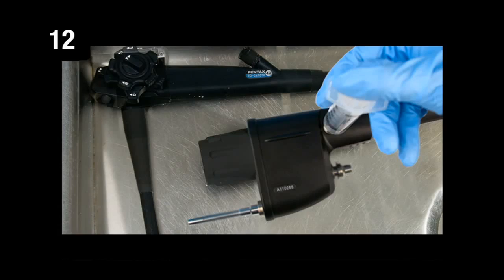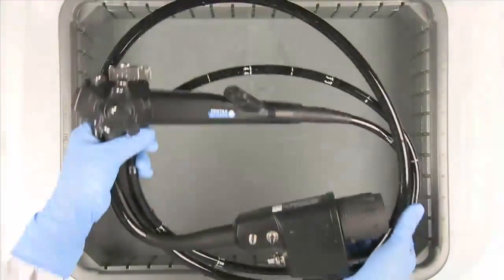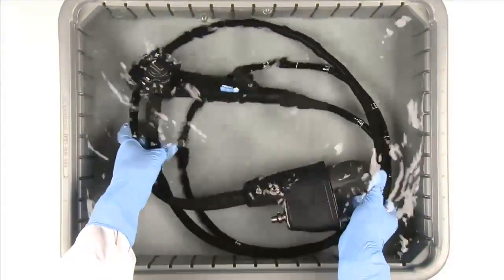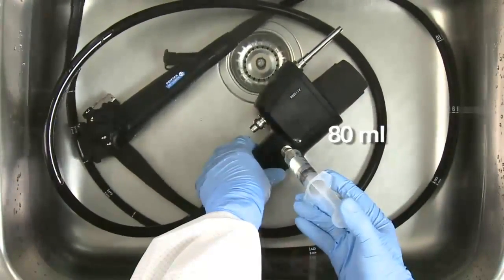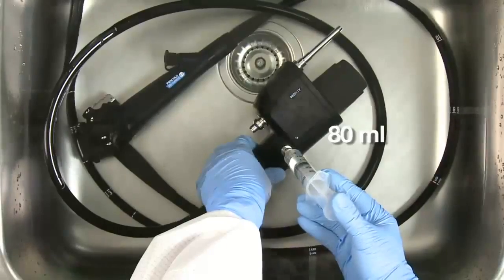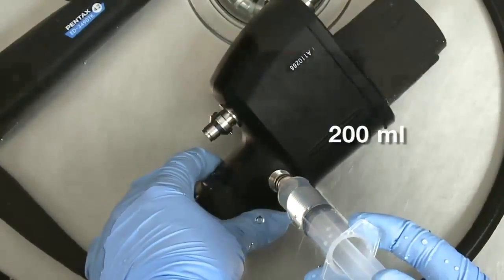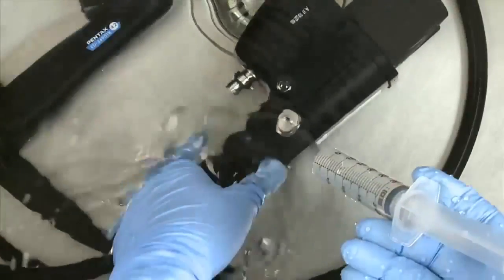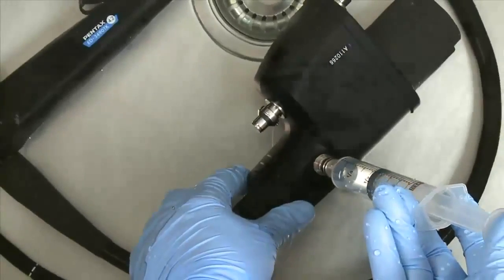Step 12. Flush the channels with clean water and rinse. Refill the basin with fresh room temperature water or transfer to a basin with clean water. Using a 60 cc syringe, flush the air-water channels with 80 milliliters of water and flush the suction channel with 200 milliliters of water. Upon completion, purge all channels with air until no water is visible exiting the channels.